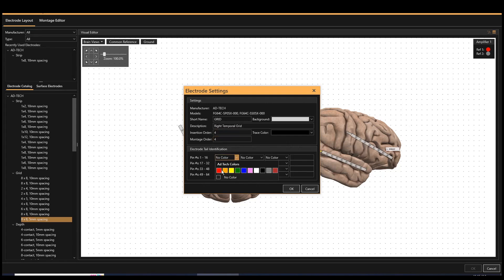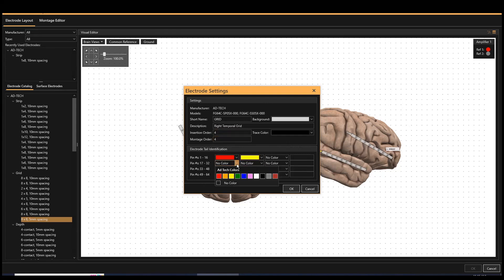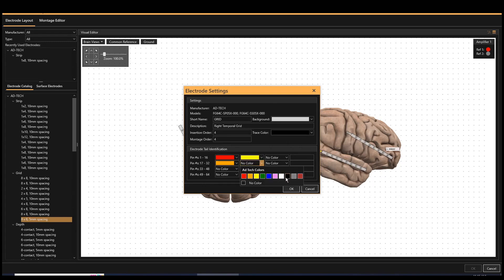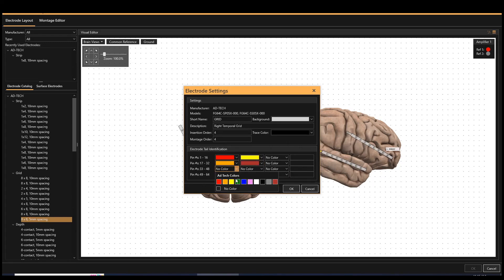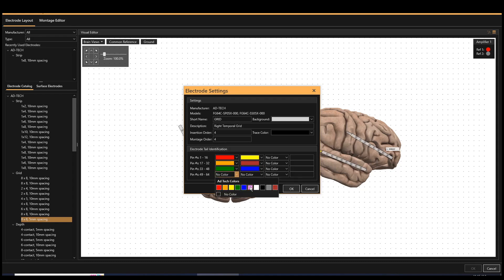You can also build this layout during pre-surgical or post-operative setup. This process captures electrode names, positions, and tail identification information.